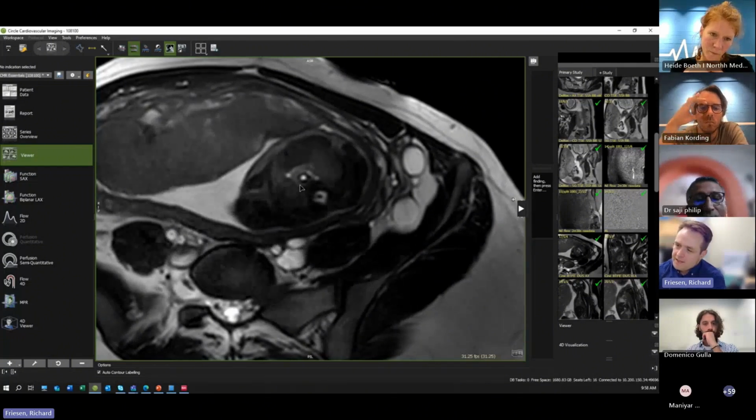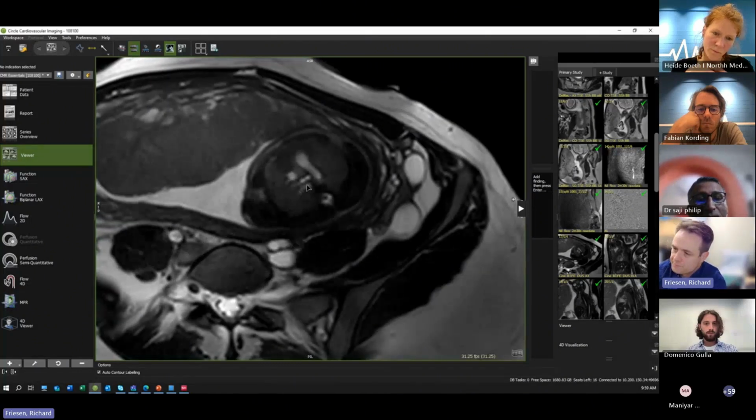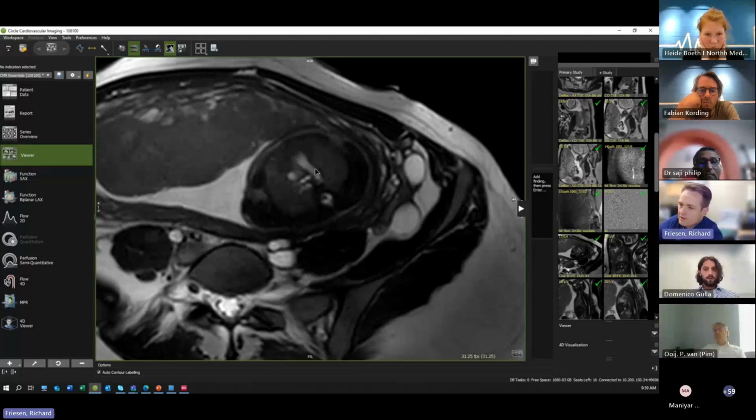You're starting to see the beginning of another vessel coming from posterior to anterior, which in initial looking at this, we said, well, this is probably just the normal azygous vein coming anteriorly towards the SVC. As we continue more inferiorly, we see our pulmonary outflow and our large left-sided ductus arteriosus, our left and right mainstem bronchi, and our SVC here.